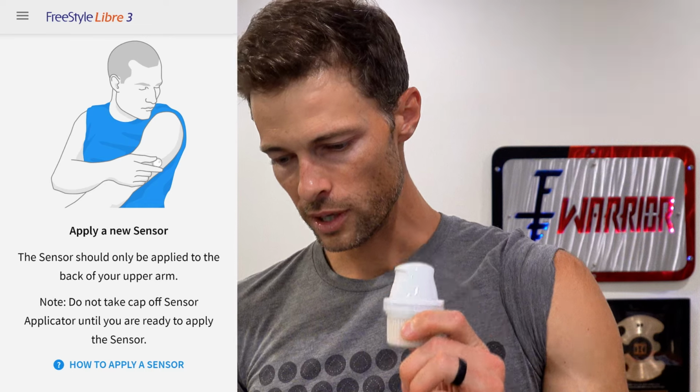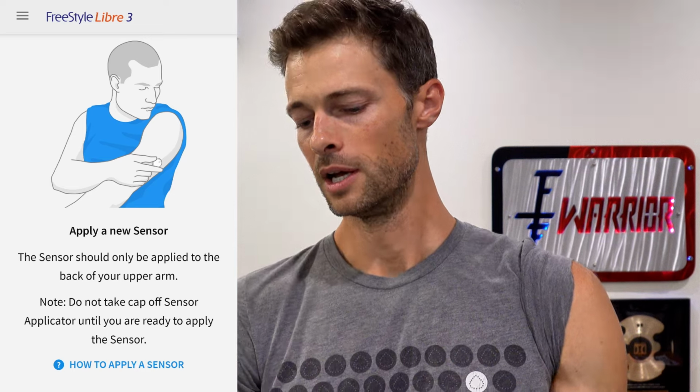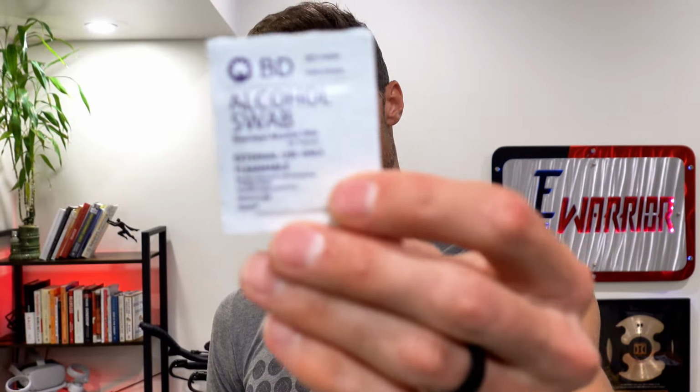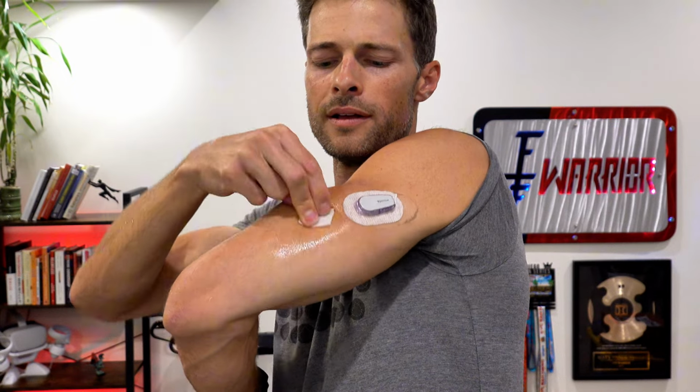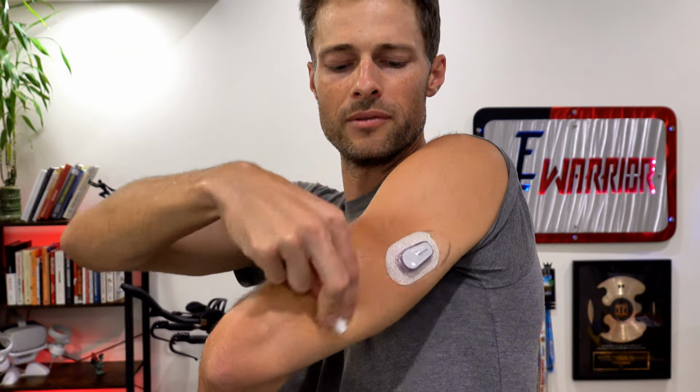So it says do not take cap off sensor applicator until you're ready to apply the sensor. So what I'm going to do first, I actually have this alcohol swab, and it is not expired. Good. So we're going to wipe the area. Okay, I'm probably going to put it down here. So we got this area, just very, I'm missing the word from my brain right now. It's been a long day, but we're gonna go ahead and chuck that. This is a very laid back sensor application. Sterile, okay, I'm ready, hit next.